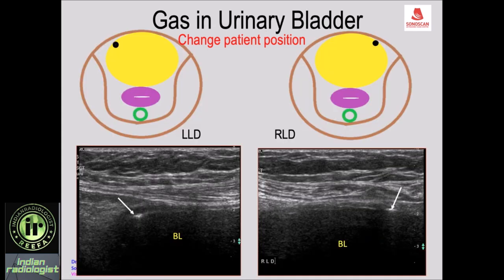Similarly, with a single bubble of gas, in left lateral decubitus it is seen on the right side, and in right lateral decubitus it is on the left side. In real time you will see the gas bubble shifting within the domain of the urinary bladder.